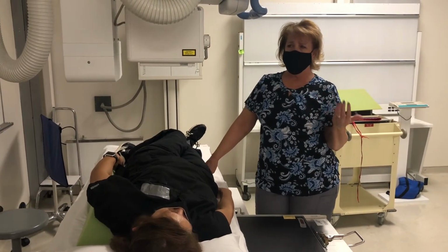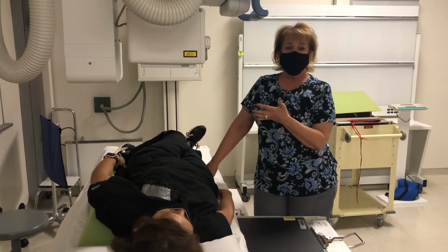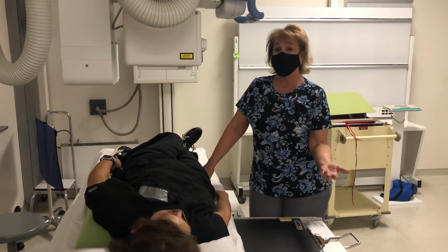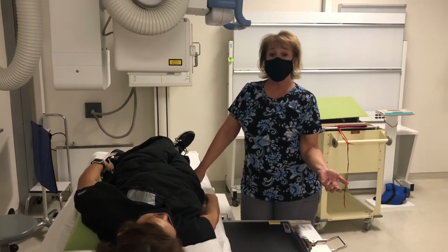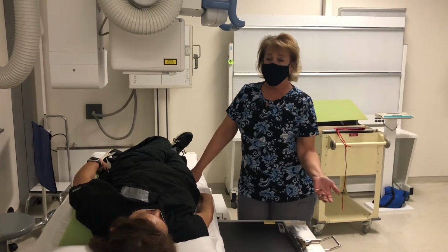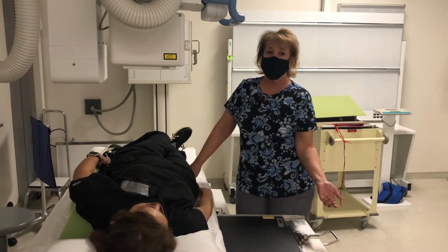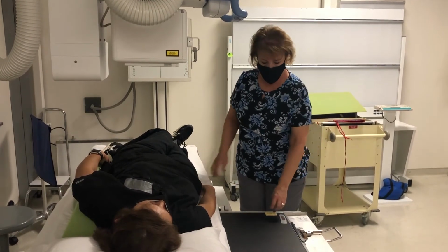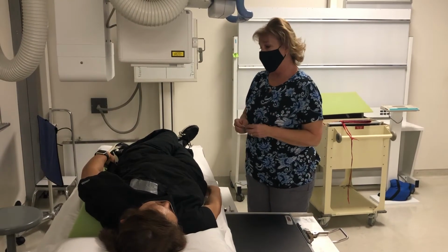So the protocol I remember following, we would take all of these images, show them all to the radiologist, and he would direct us to either do a post void at that time, or he might say, wait another 10 minutes, show me a KUB at 45 minutes, and then make that determination. So it's a combination of showing the radiologist and following the protocol.